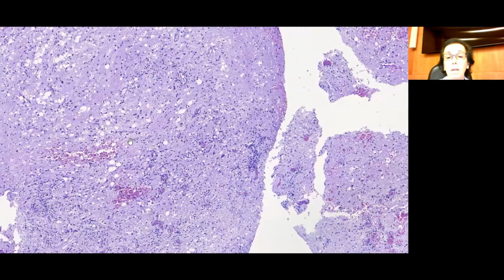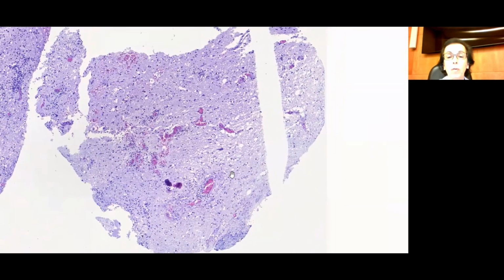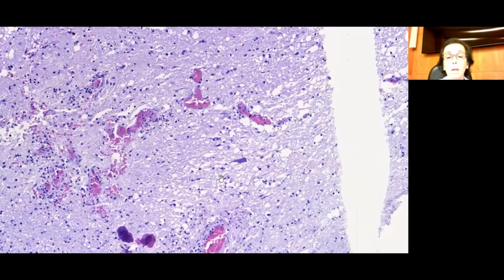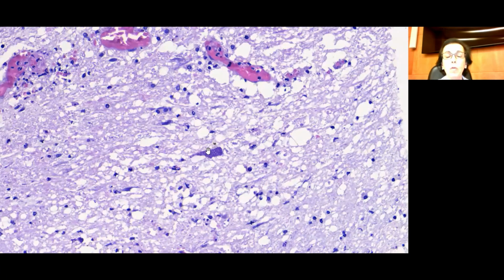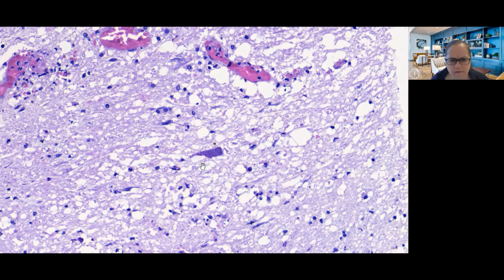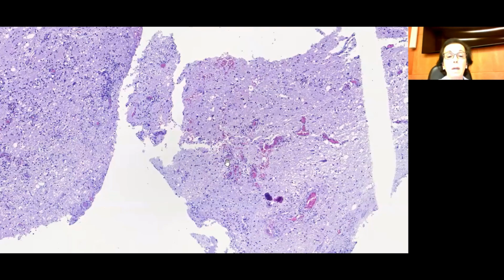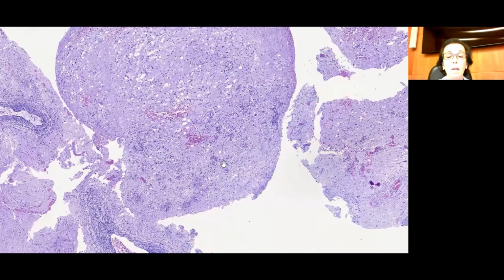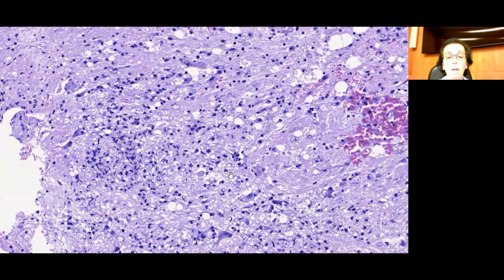Sometimes it's not easy, but here, for instance, if I go closer, this is one of the illustrations, the slides I showed. It's beautiful. Yes, you can see it. And here, let's see if I find it.